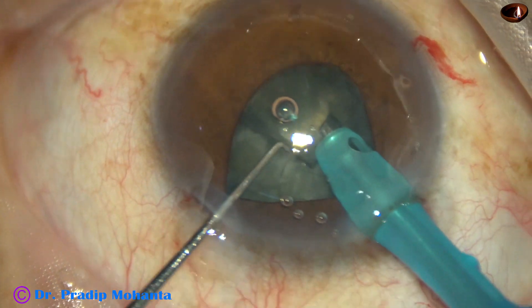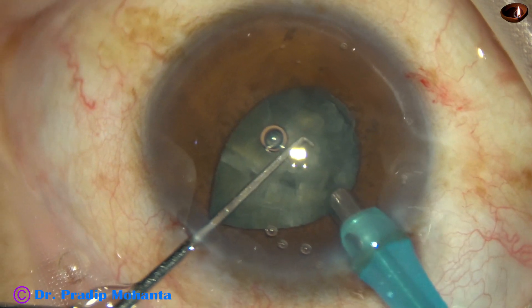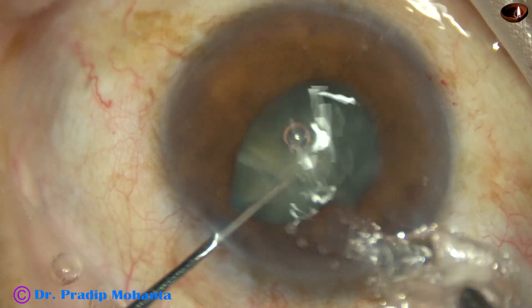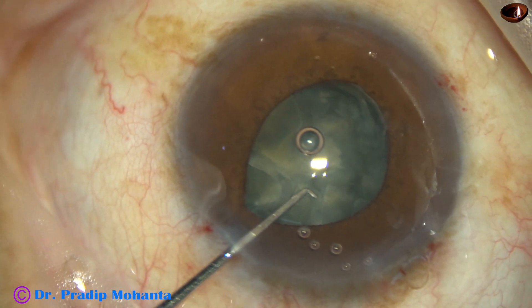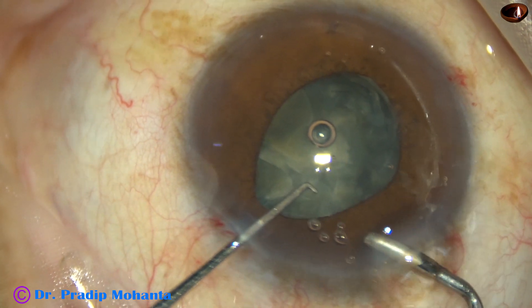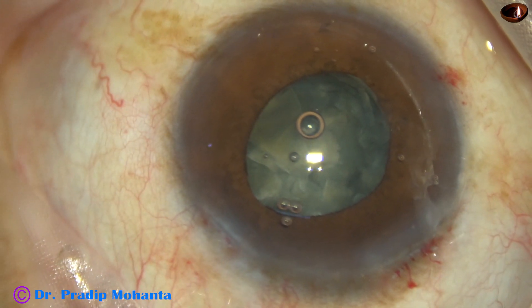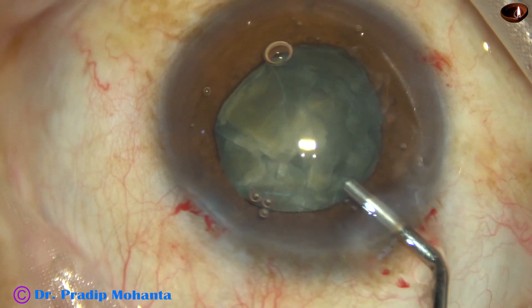Five chops and six fragments. Now I remove the handpiece but I don't remove the chopper. I inject some viscoelastic and let the iris fall back, then I remove the chopper. This is to protect the iris.